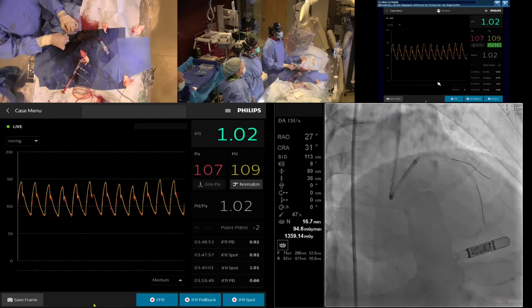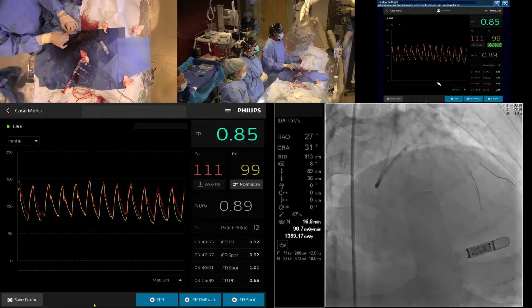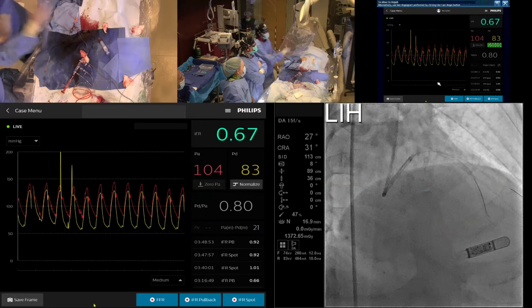Okay. All right. Fine. We were not allowed to say fun during the case of a PCI. Let's see how, but can we screw up that diag so we have to fix it after all? No, I want to see. There you go. That's what I wanted. Now, why is it doing that? Well, because the diag is diseased. You know why? I'll tell you why. Because there's a second lesion.